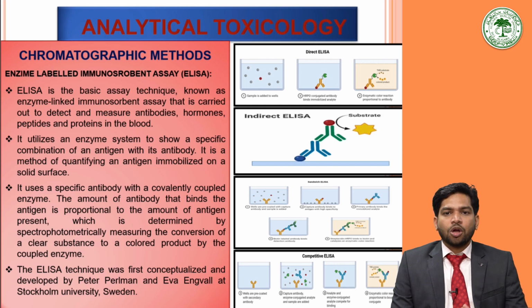Depending upon that, the non-competitive is again of two types. The one-step non-competitive immunoassay, in which samples like blood or gastric contents suspected to contain the drug X, that may be morphine or strychnine, are mixed with the labeled antibody against it, that is ABX.